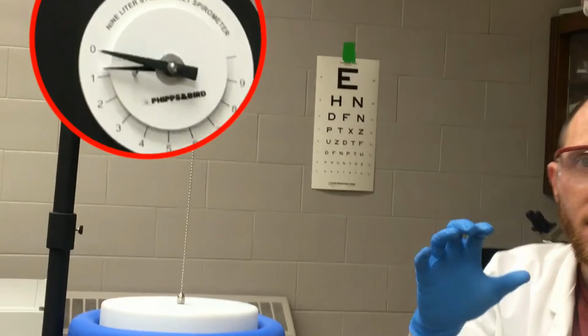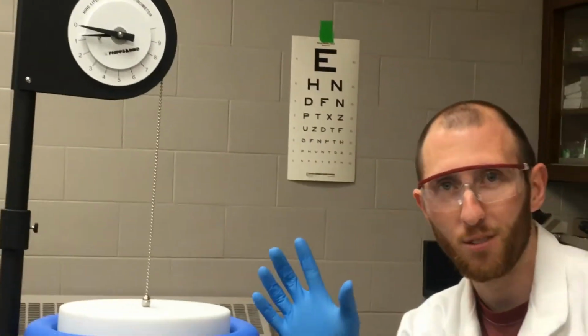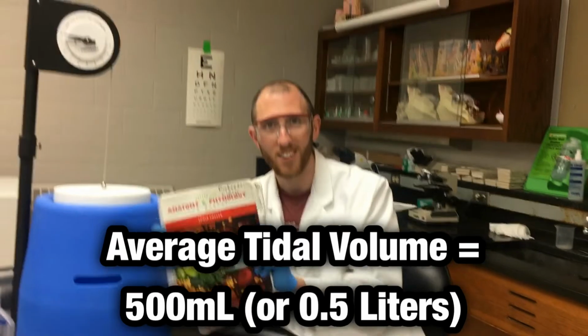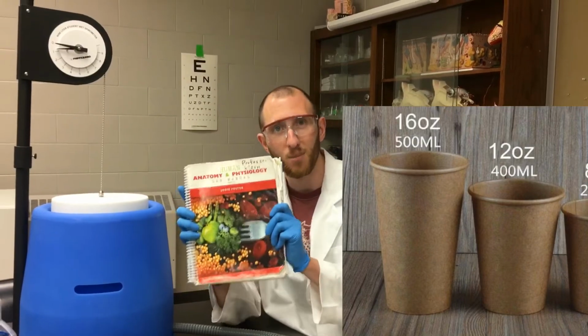That was about 600 milliliters or 0.6 liters. Average tidal volume from your lab manual is 500 milliliters. It's a very important number to know. Tidal volume normally is 500 milliliters.